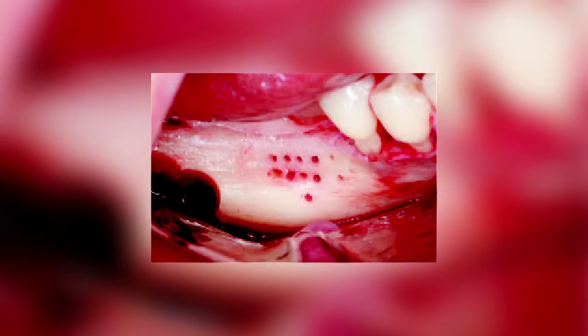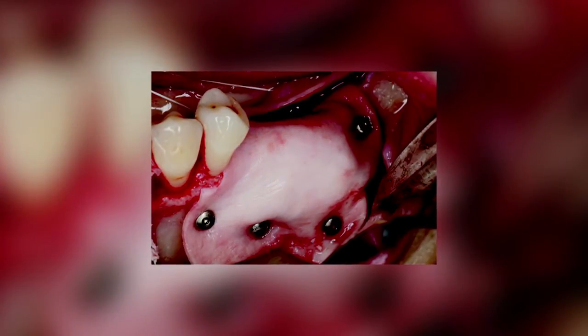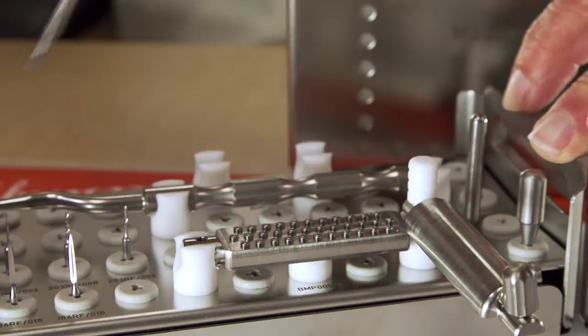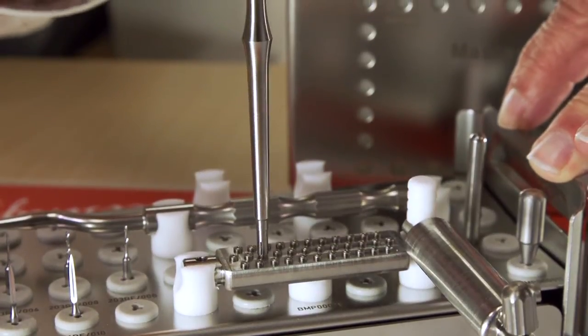All Meisinger pins are 3.5 millimeters in length and contain two small barbs which actively hold the membrane and pin securely in place. The Meisinger pins are easily picked up using the pin holder or handheld pin placement device.